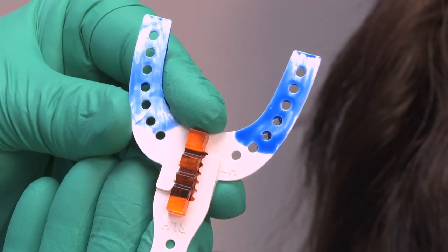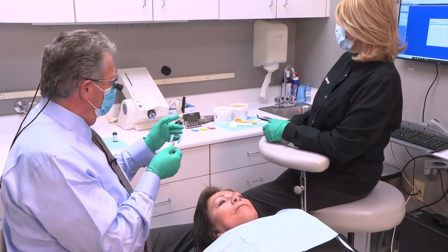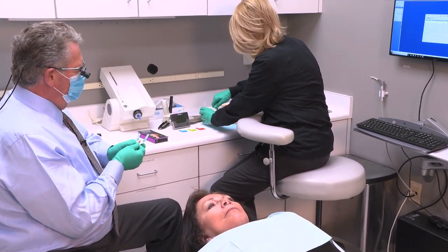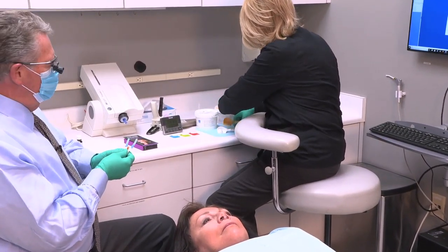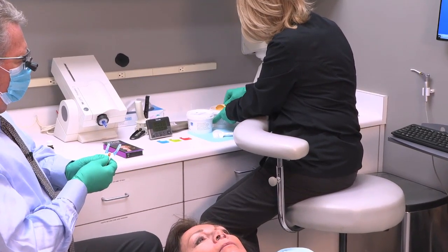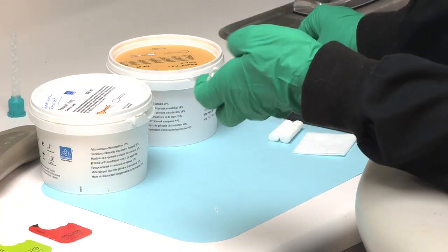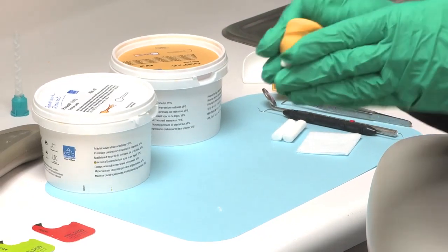So we now have our bite fork and our handle assembled. And Tammy, if you'd like to go ahead and start to mix the putty. She's going to take a scoop of each, the base and the catalyst. And you only need about half a scoop. You don't need a full scoop. And she will mix it up. And she'll start her timer.